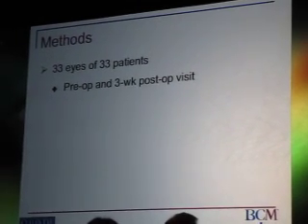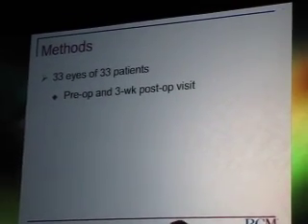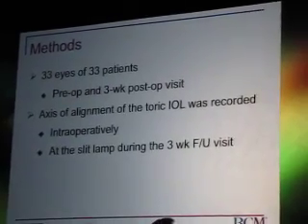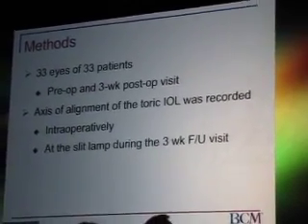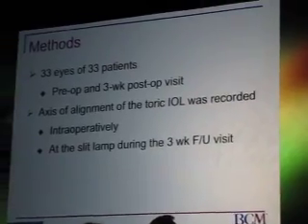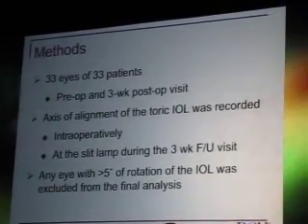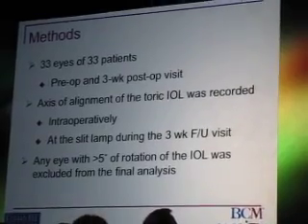And so far I'm reporting on 33 eyes of 33 patients seen preoperatively and 3 weeks postoperatively. The axis of alignment of the IOL was measured, of course, intraoperatively, and then I personally measured it at 3 weeks follow-up, and we threw out any eye that was over 5 degrees off, so we'd have real tight numbers.